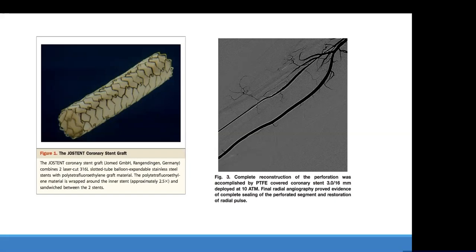You can put a warm compress, you can inflate the pressure cuff for 10 minutes and then deflate it for the reperfusion, which can produce nitric oxide that can prevent the attachment or the entrapment of the radial sheath. You can also sedate the patient deeply, because if it's due to anxiety and patient awareness, deep sedation with propofol can help relieve that. You can call anesthesia to deeply sedate the patient, but don't pull too hard. If you pull too hard, you will avulse the radial, and then you convert a small problem into a bigger problem.